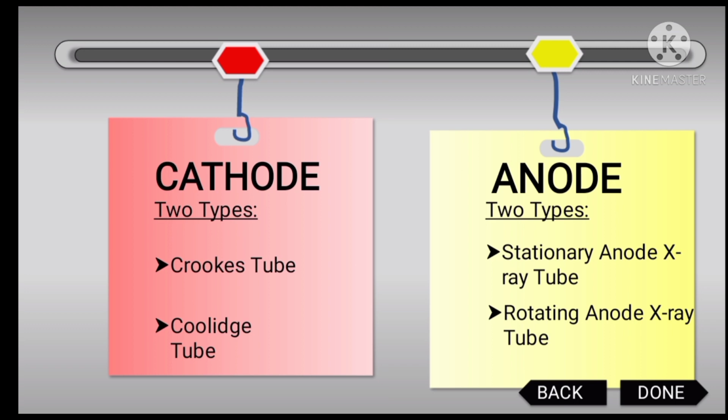All that energy coming from the cathode side to the anode side produces a huge amount of heat. If that heat keeps hitting the same spot over and over again, as in a stationary anode tube, eventually the surface of the anode can deform and the angle of the X-ray beam will shift, reducing dose efficiency and the overall image quality the tube is capable of producing. In the case of a rotating anode tube, the heat of the incoming cathode beam is dispersed across the entire surface of the anode as it rotates. This enables rotating anode users to perform longer scans and at higher doses.